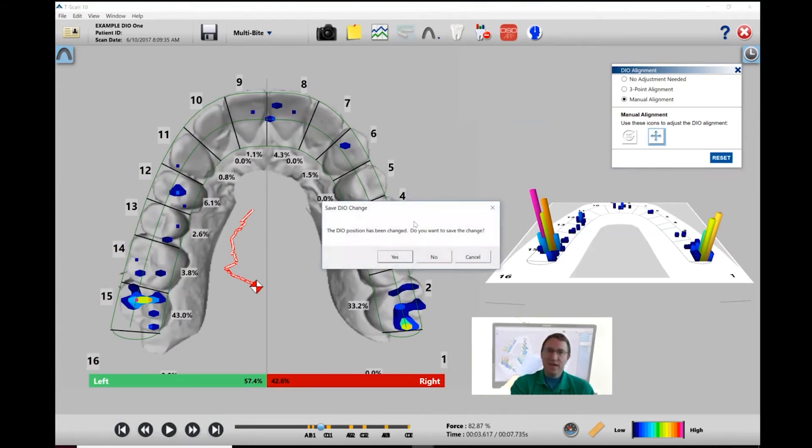Make any changes, hit yes to save those changes. I'm just going to hit no.